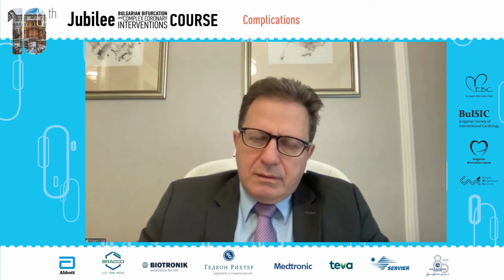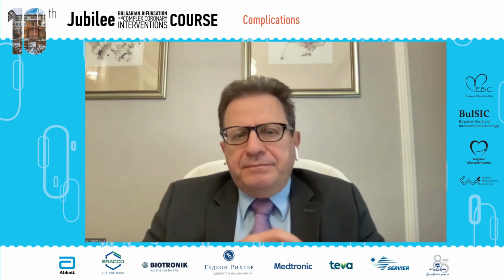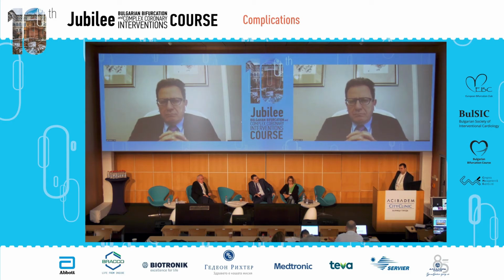Rota and Shockwave. I fully agree with you, but I couldn't pass through the distal lesion, and I have tried the shockwave balloon just a few times. It's quite a bulky device, and I tried with a 2.0 balloon and a good new 2.0 balloon, and the balloon didn't pass.